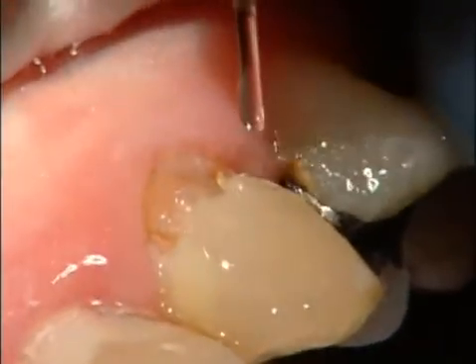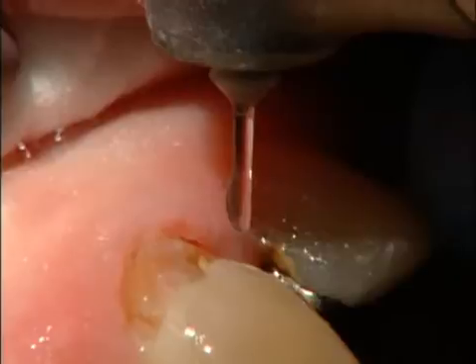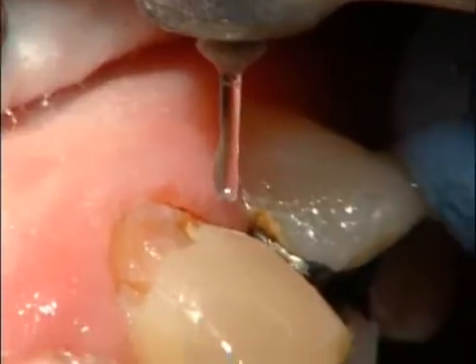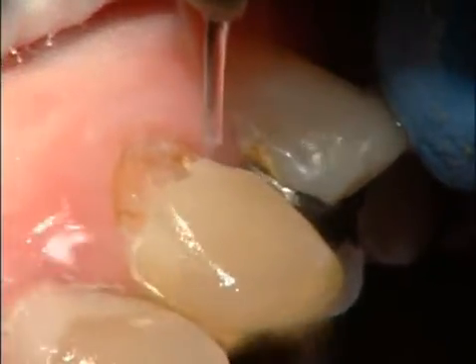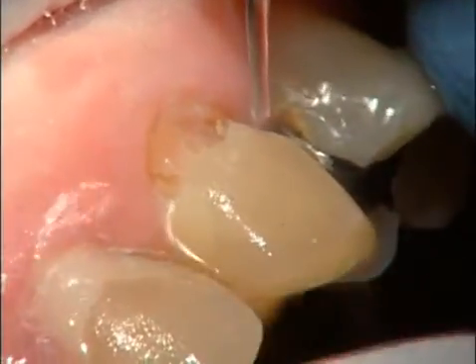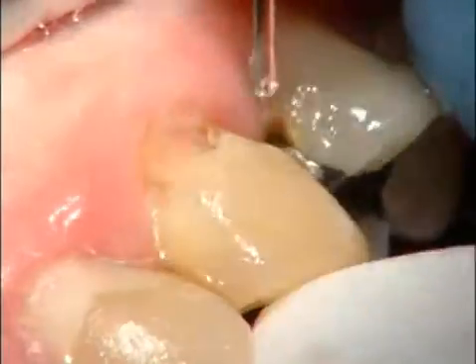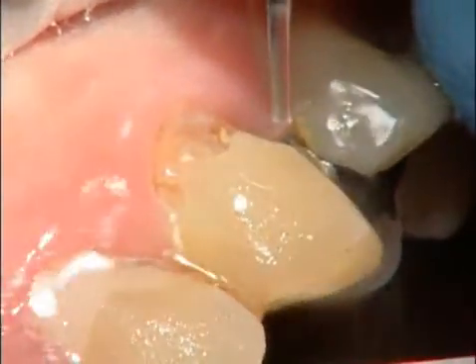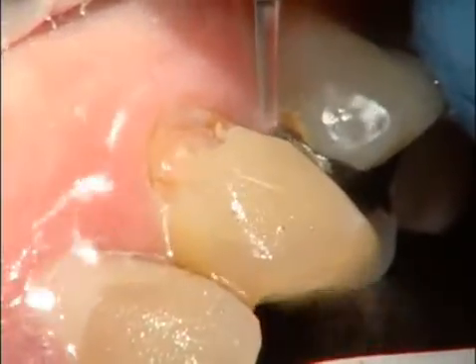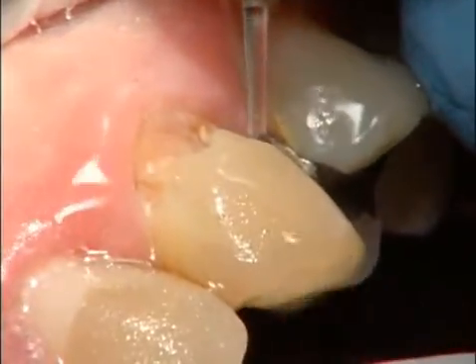After removing the old composite and decay, it's easy to go in with a T4 tip, 2.75 to 3.25 watts to place retention, mesial and distal on the incisal angle. Again, noticing that I'm parallel with the adjacent amalgam.